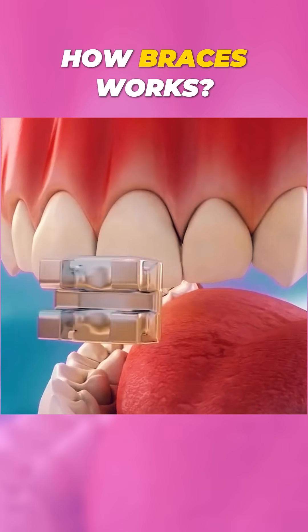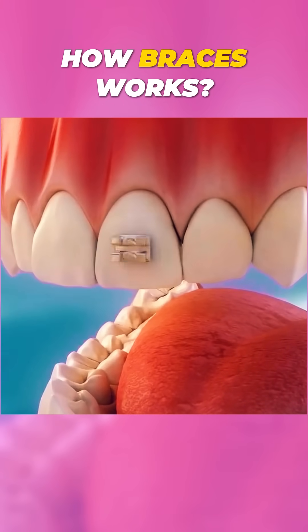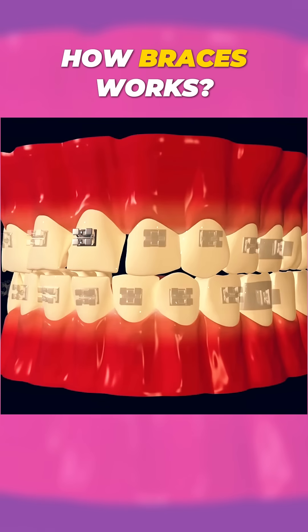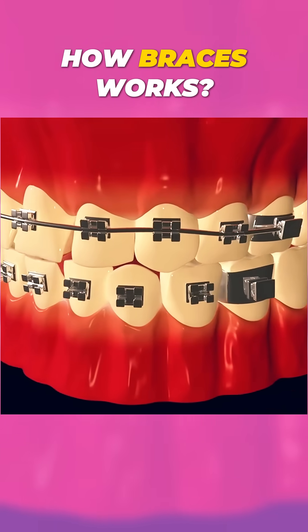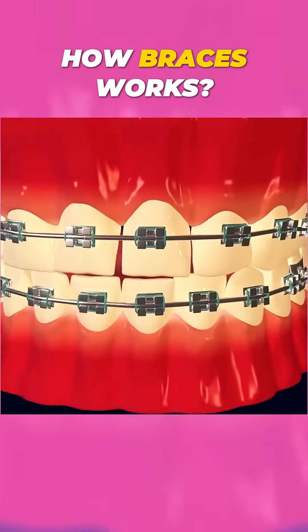First, brackets are glued to each tooth. These act like handles to hold the wires. Next, a thin wire is threaded through the brackets. This wire applies gentle pressure to move teeth.